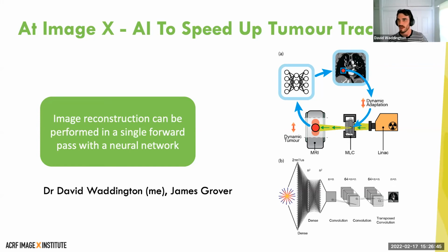They've also proved to be better than usual methods of turning that K-space data off the MRI scanner into an image, and they can do it really quickly. So one of the things we've been implementing on our scanner is using these networks to perform that operation and track moving tumours or moving phantoms, tumour-like behaviours. Sony from the summer student cohort this year has been working with me on that, and James Grover has been really important to that effort as well.